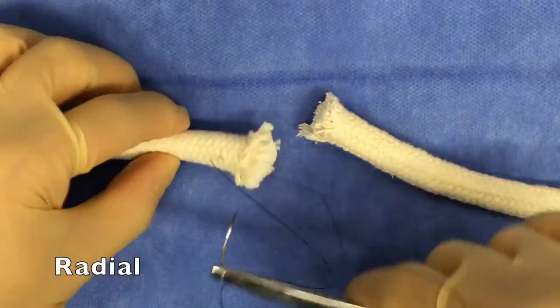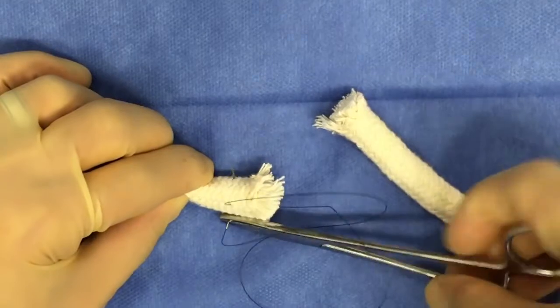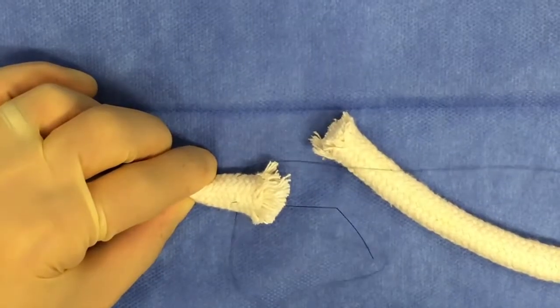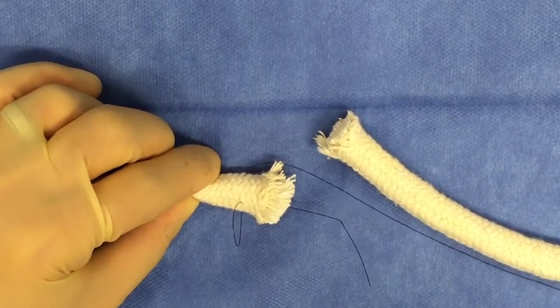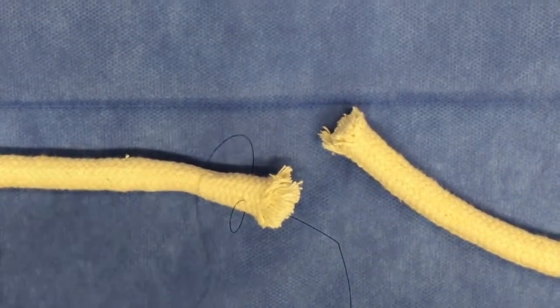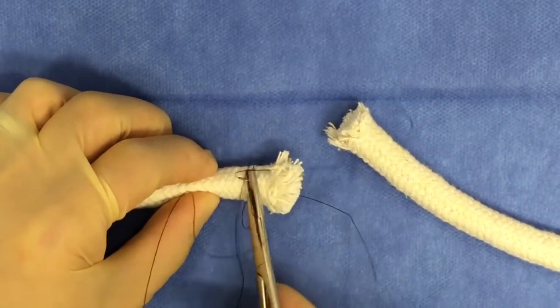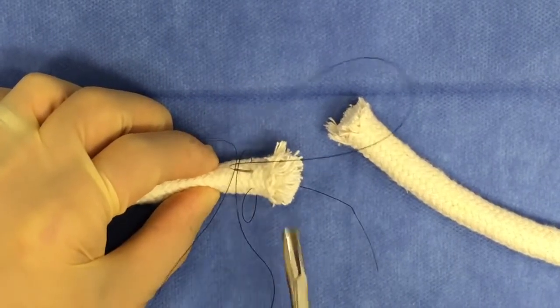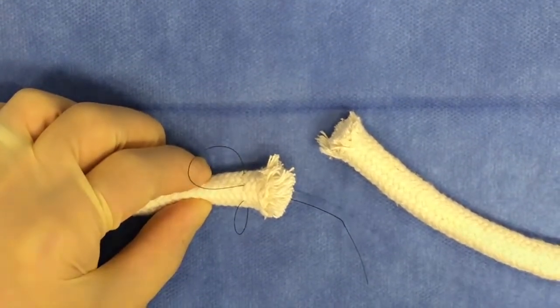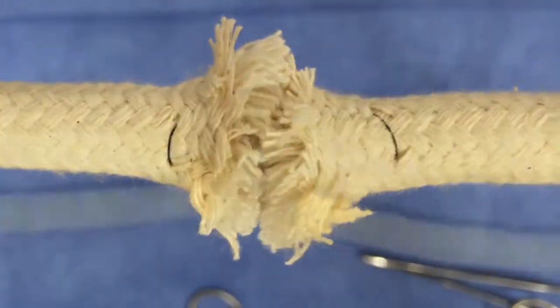The first pass is the same, but instead of threading your suture needle behind the tendon, you're actually going to suture through the ventral aspect of the tendon itself. Your next throw, however, will be no different than what we just showed in the demonstration of the sliding mattress pattern suture. You're going to go through the dorsal aspect of the tendon, the exposed edge of the tendon, and you're going to come out in the cut end of the tendon. And you'll complete the exact same pattern on the other side in order to bring the ends of the tendon together. The final appearance looks like this, with less of that suture being exposed on the outside of the tendon.